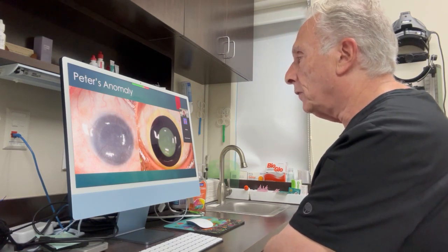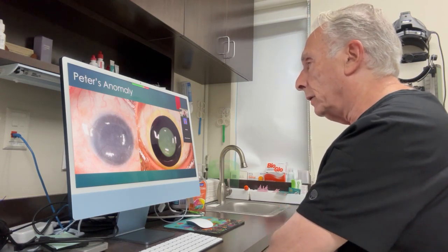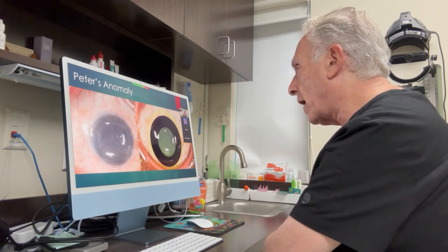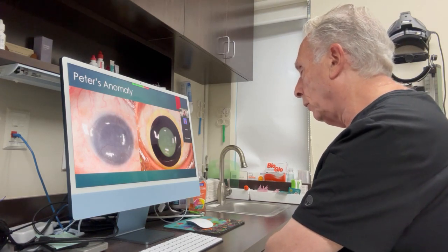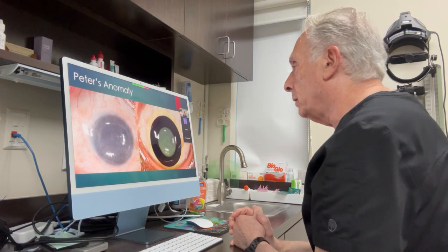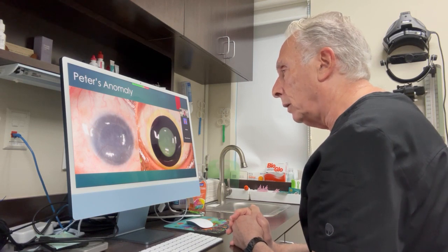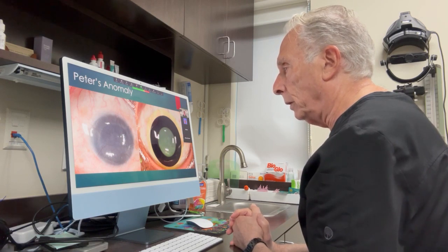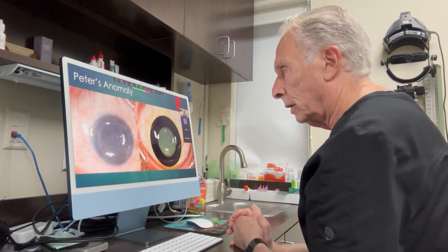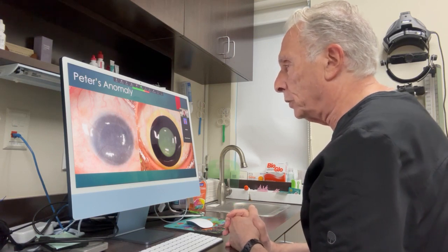And to give her a pupil, we fit this eye with a blackened soft lens. We gave her an 8 millimeter clear pupil, and over that we put a scleral lens. With the blackened soft lens and the scleral lens, the patient has 20/80 vision. Without this scleral lens, soft lens combo, the patient's visual acuity is basically hand motion. This is her only eye. She lives by herself also. And she has a job now. She works in a nursing facility and empties out the trash and does menial work, but she has a job.